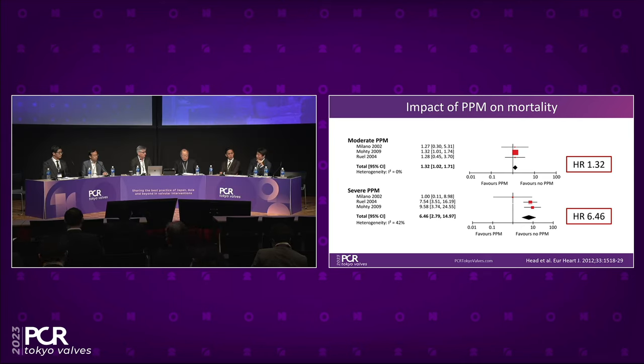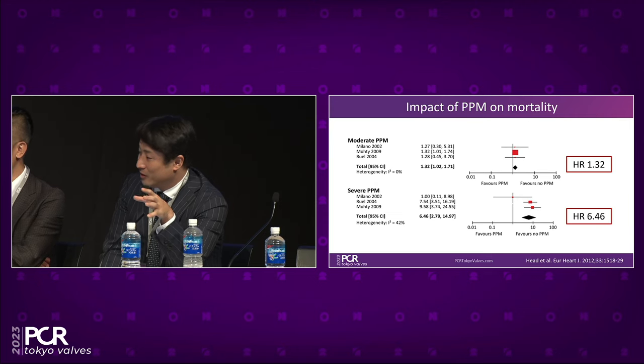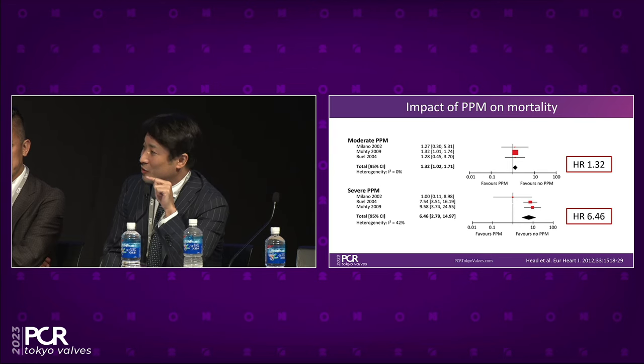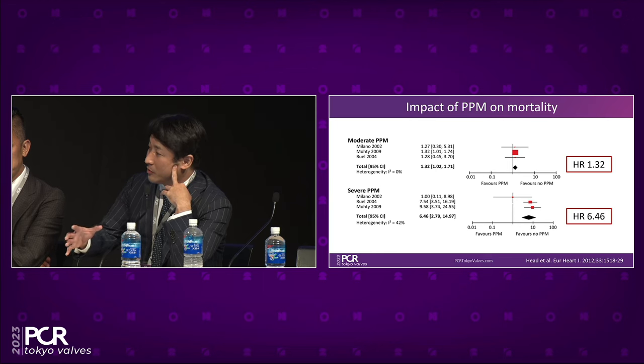Yeah, I'm really interested in this case using the Navitor valve, because a body surface area of 1.57 is relatively large in our cohort, with a small annulus. A very high BSA is associated with increased risk of PPM after the procedure. So in my daily practice, I would like to use a supra-annular design, but I would like to know the result of this patient using an intra-annular design. Yeah, it's very interesting. Based on the concept of preventing PPM, I think not only the annulus area but also the body surface area is important. So we should pay attention to such patients.